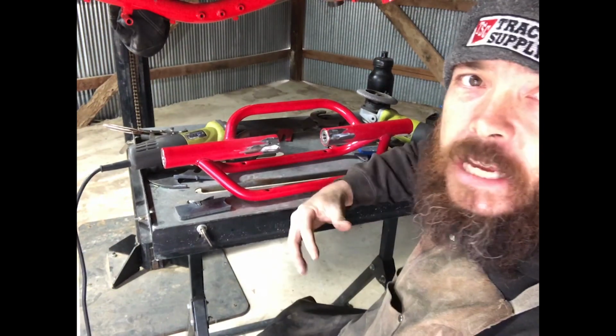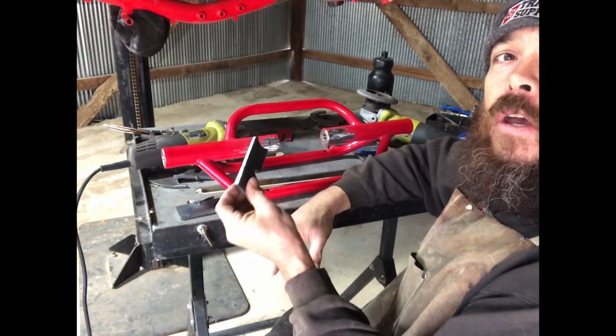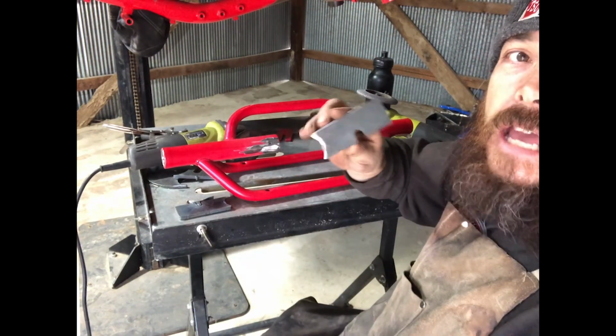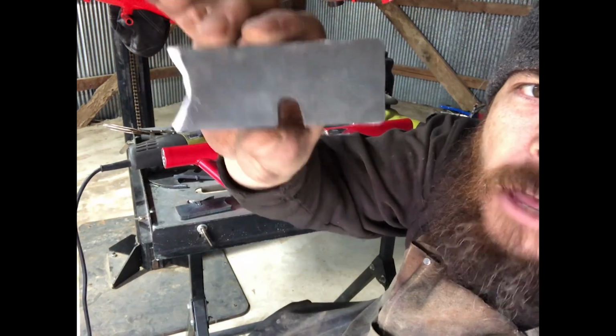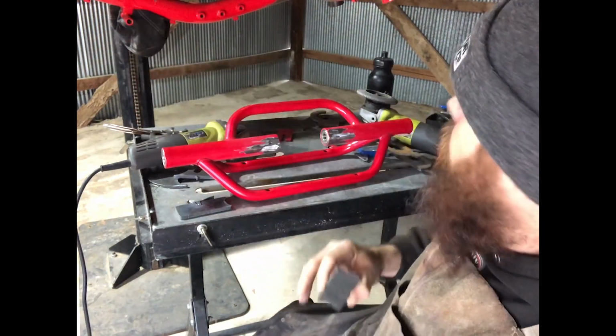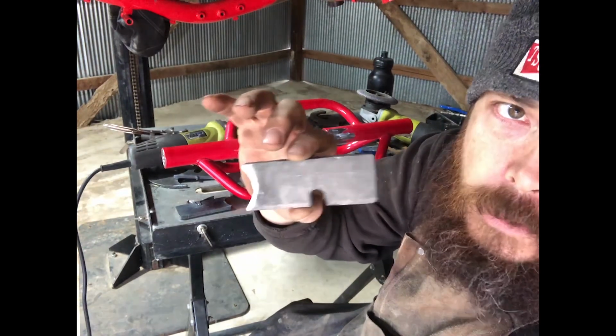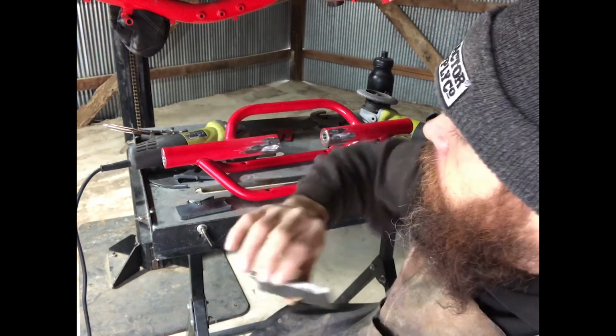But anyways, we'll continue. So I'm gonna mount this onto here like so. I got this little notch in here to help me line it up with the existing swing arm wheel bolts, location dropout.